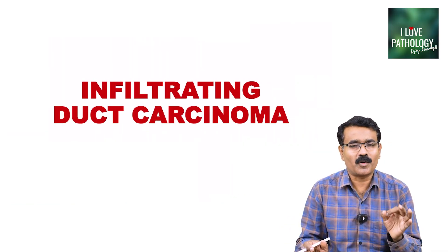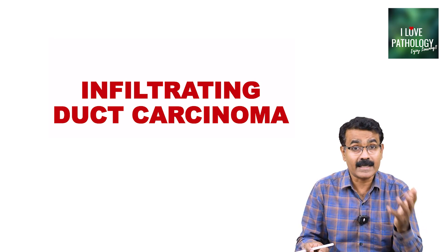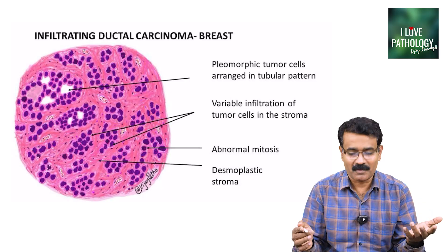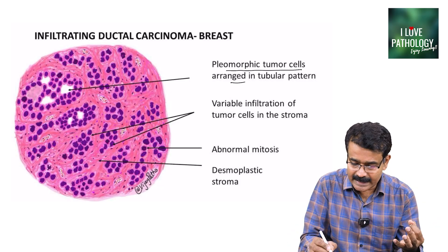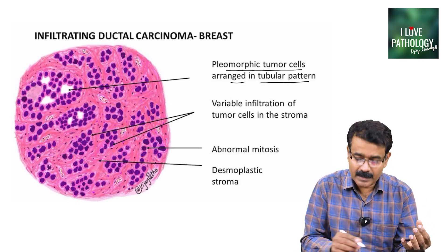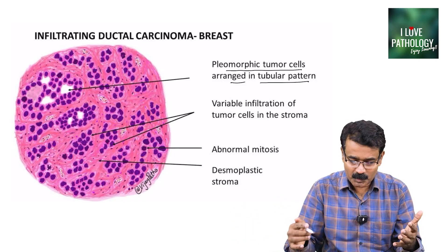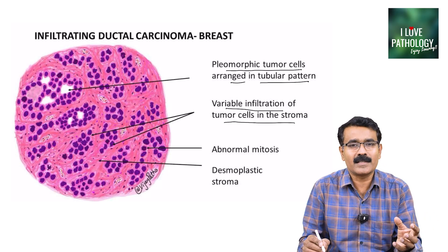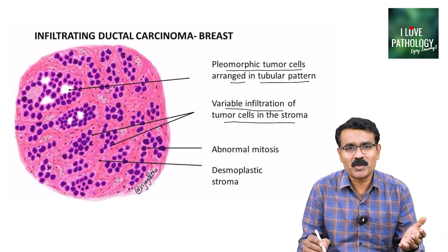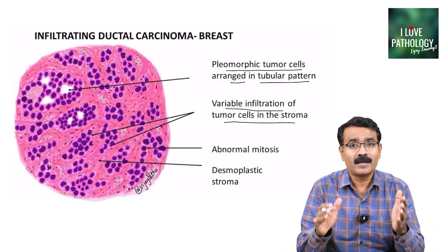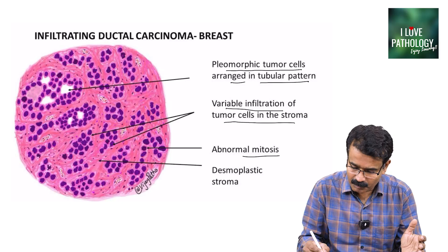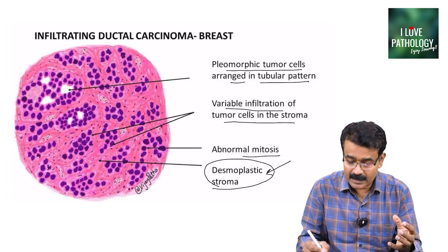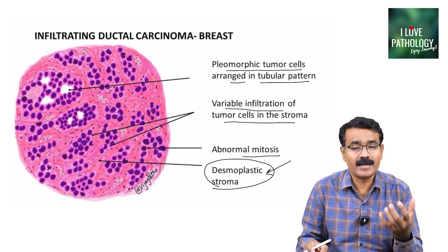Moving on to an important malignancy of the breast: infiltrating ductal carcinoma. As the name says, it is a malignant neoplasm, so the tumor cells are pleomorphic. These pleomorphic tumor cells are predominantly arranged in a tubular pattern. As the grade increases, the tubular pattern becomes solid, with variable infiltration into the stroma. Invasiveness is the feature of malignancy — if pleomorphic tumor epithelial cells infiltrate the stroma, you are looking at infiltrating duct carcinoma. You can find abnormal mitosis and abnormal proliferation of stromal cells, referred to as desmoplastic response or desmoplastic stroma.